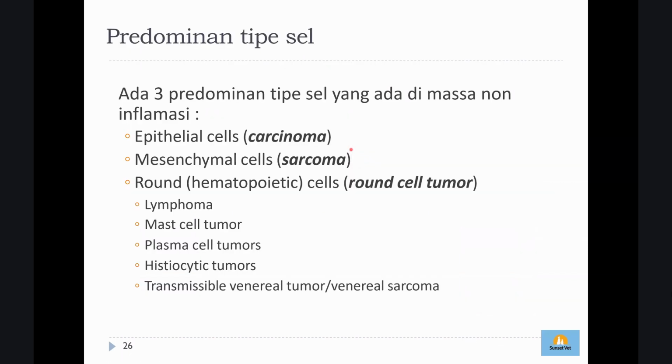Okay, going back again. What is the most dominant cell if it's cancer? Is it epithels, mesenchymal, or round? The epithels are supposed to be in clusters. The cells need to attach to each other because that's typically epithels. Our skin is built from the epithel. And then the mesenchymal or the sarcoma ones, usually they will have wispy tails. Wispy, you're going to see it looks like fibroblasts.